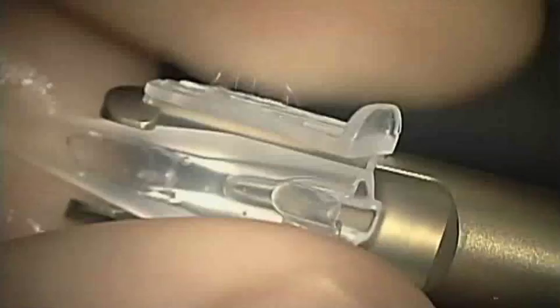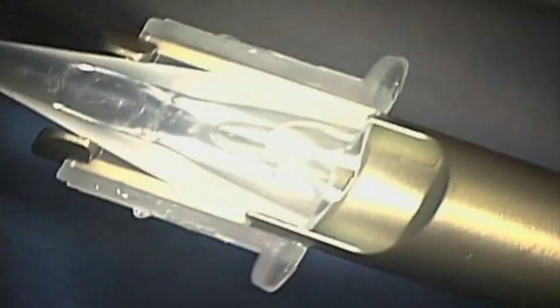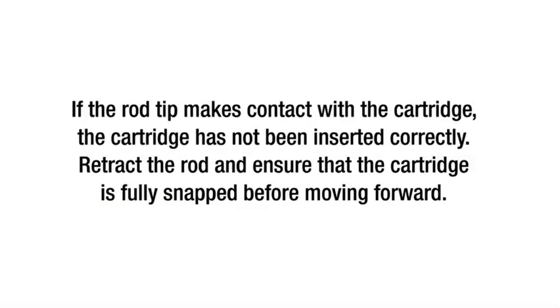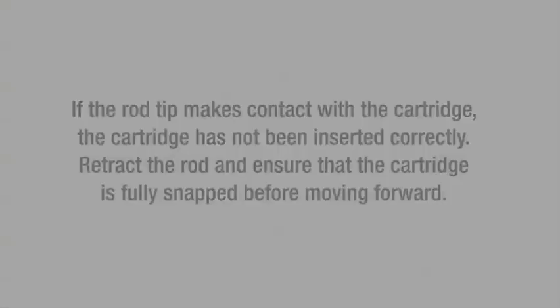Insert the cartridge bevel tip first so that it slides into the handpiece cartridge slots and push down firmly on the back end of the cartridge to securely snap it into the handpiece. If the rod tip makes contact with the cartridge, the cartridge has not been inserted correctly. Retract the rod and ensure that the cartridge is fully snapped before moving forward. You are now ready to insert the Tecnis one-piece IOL.